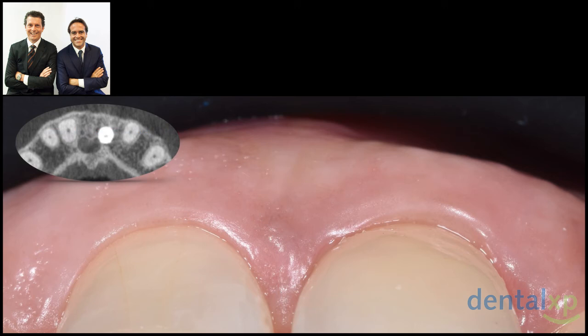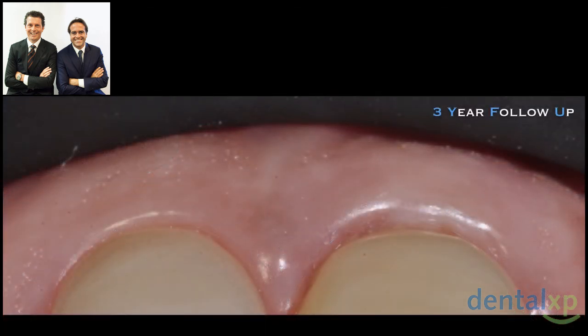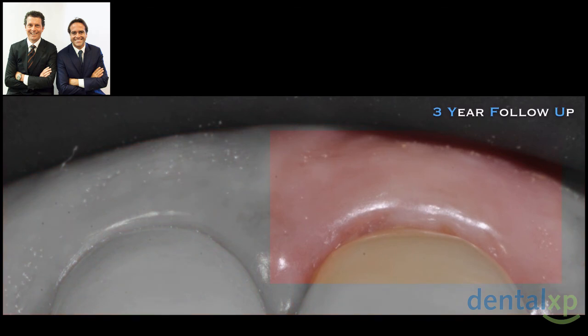Yes, the connective tissue graft shape is visible, but the interesting aspect is what we have seen down the road. Take attention to this specific moment, because this is what changed our vision at 3 years. You see, time 0, look at 3 years. If I do a higher magnification of 3 years, what are you seeing? You're seeing basically creeping of this connective tissue graft, which keeps maturing.